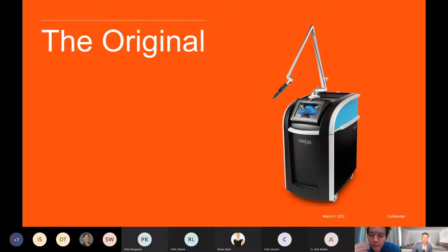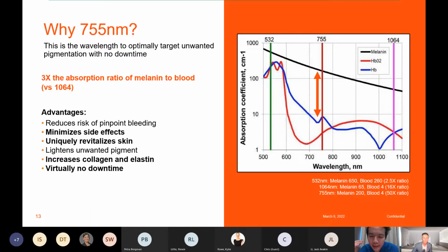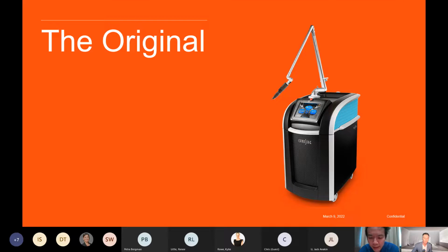Okay. And then the focus lens itself treats the acne scarring, the open pores, the skin rejuvenation. And then the zoom handpiece, we use for targeted lesions like lentigo, Hori's nevus, ABNOM, and all that. And also for tattoo removal. It's not big in Singapore, but I suspect it's a bit bigger in Australia and the US for tattoo removal. Excellent. And so what about power on the original and also startup time?